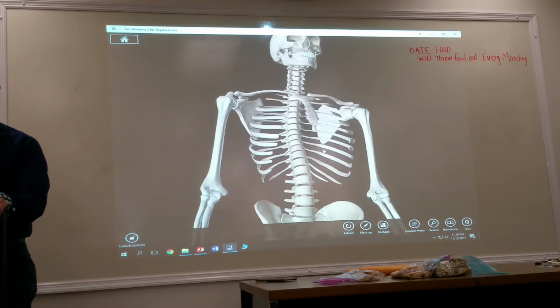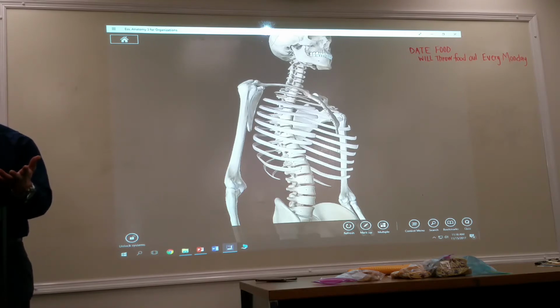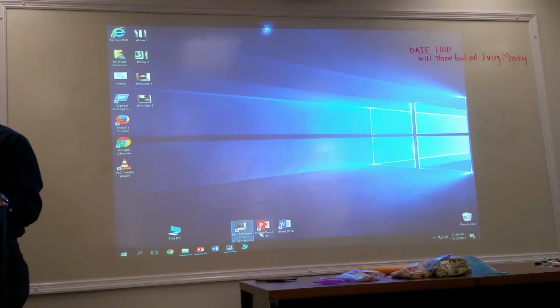The ribs become elongated, and it puts this lung in true profile. So the right becomes foreshortened, whereas the left becomes open. It opens it up. So if we go back to our radiographic image here, sorry about that. What happened here? Okay.